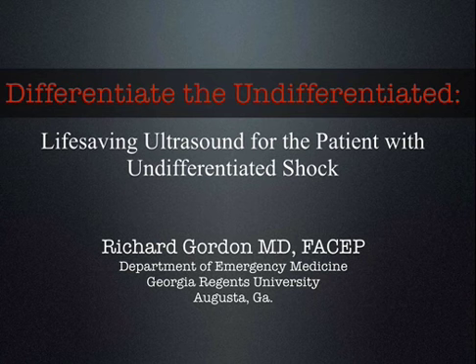So originally I was going to talk about the approach to the undifferentiated shock patient, and had that ready to go. A lot of that is physical diagnosis stuff. A lot of that's not really new. So secretly, I kind of wanted to present this one to you and was feeling it out yesterday while we were doing ultrasound, and there seemed to be a really big interest. So this is really more the cutting edge stuff in the management of the undifferentiated shock patient. I'm thrilled to actually get to present this to you. This is how we use ultrasound to differentiate that undifferentiated shock case.